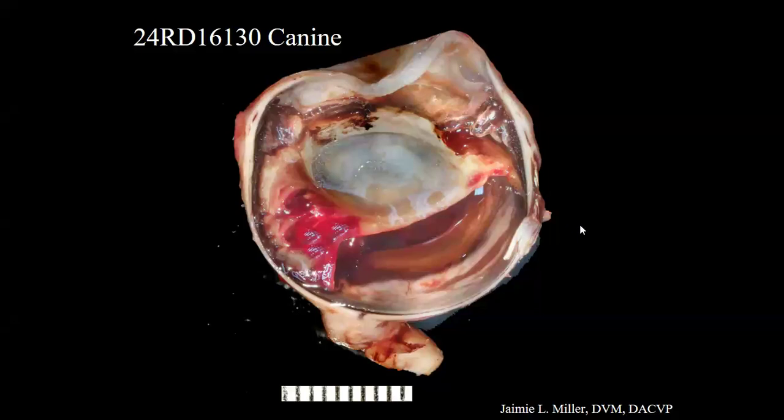This is the left eye with the findings clinically of moderate diffuse edema, a deep stromal vascularization that went all the way around the globe. Had some axial superficial stain uptake, 3+ flare. They describe posterior synechia and iris bombé. Mature cataract in the lens, and there was either lens material protruding or possibly granulomatous inflammatory debris is what they described clinically. It was glaucomatous.